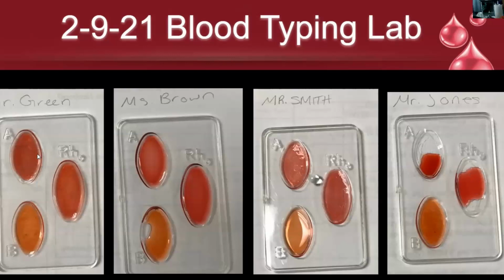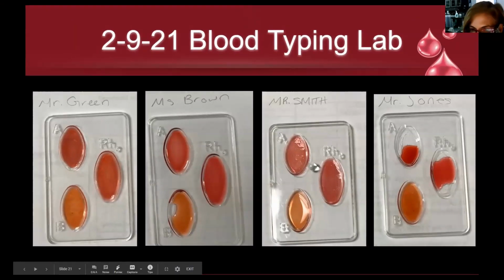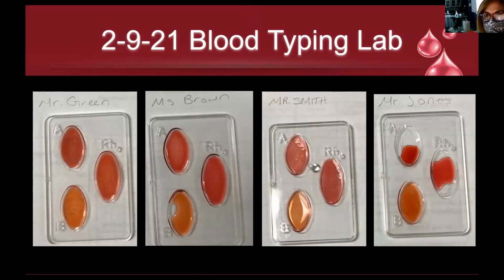Okay. The important thing is that you know how to read these samples. So if you can look at Mr. Smith, even though you have a different result, if you can look at that and say A positive, you accomplished what we needed to accomplish. Okay, thank you. So we just have a couple questions to finish on that. We'll turn that in today, and then we'll hit the last piece of this tomorrow, which is the genetics component.